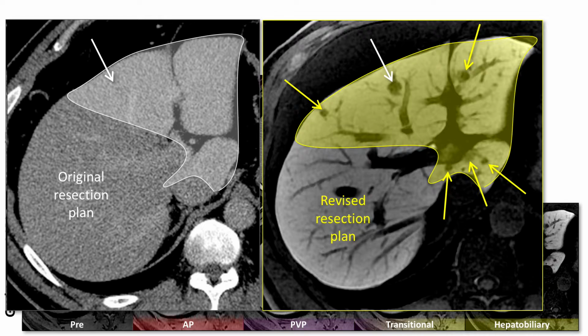Yes? You're saying that gadoxetate acts as a blood pool or an extracellular agent in the early phases, right? So why is it necessarily bad for detecting hemangiomas? I think we'll get to that later, but the main reason is that it's not so much that it's bad at detecting hemangiomas, it's just that one of the ways that we characterize hemangiomas is we like for them to follow the blood pool. So when you give an extracellular agent, the blood pool stays bright, right? So it's bright on the arterial phase, bright in the portal venous phase, bright in the delayed phase. So if we see a lesion that holds on to contrast, we say, okay, that's a hemangioma.